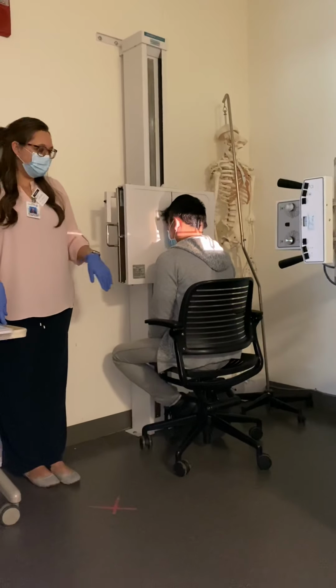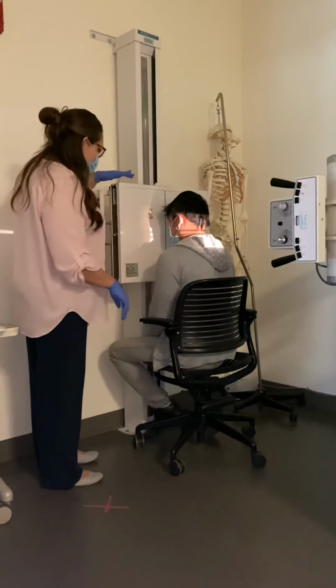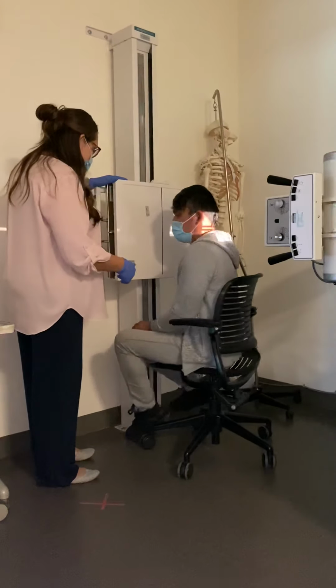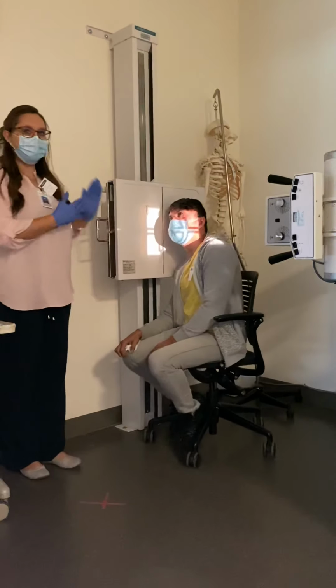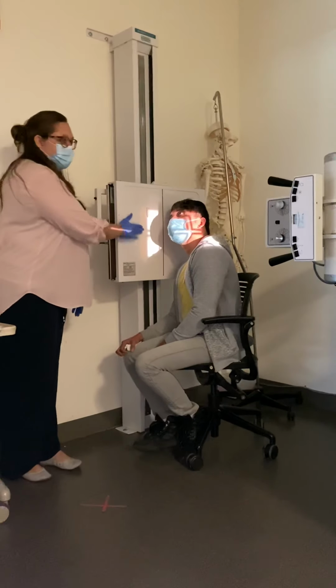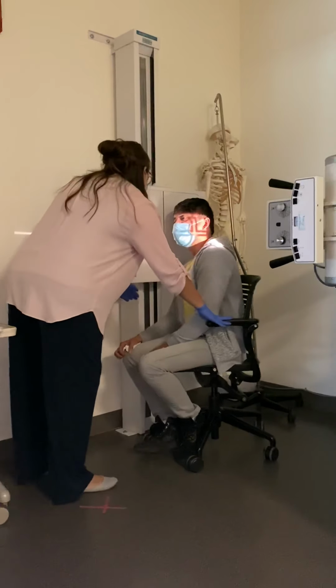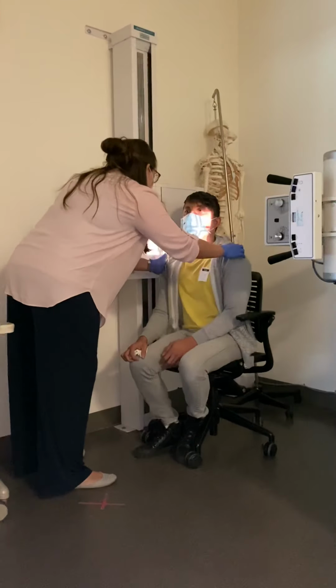Then what I'm going to do is the axial laterals. So I'm going to have my patient rotate in a true lateral position, so face me. This is different than the other laterals that we do, where we put the patient in a 45-degree oblique so we can get the patient close without OID. What we want to do is keep them in a true lateral so their shoulder is touching the board.